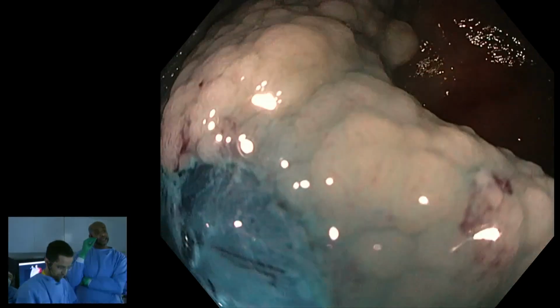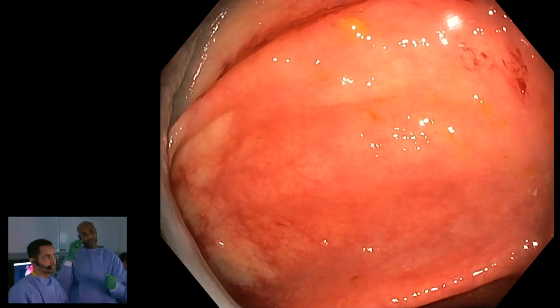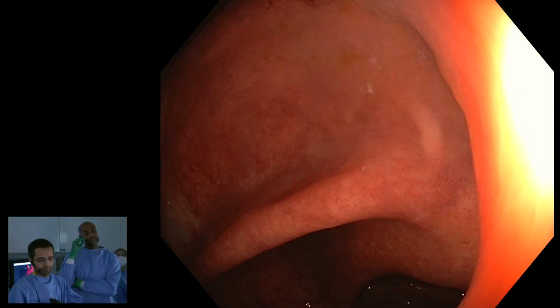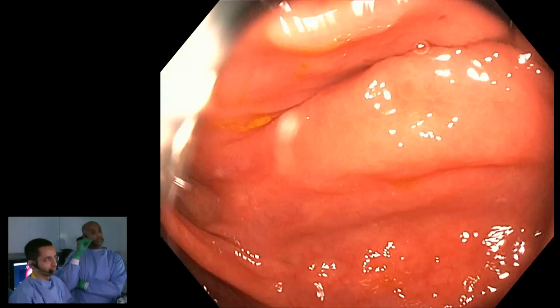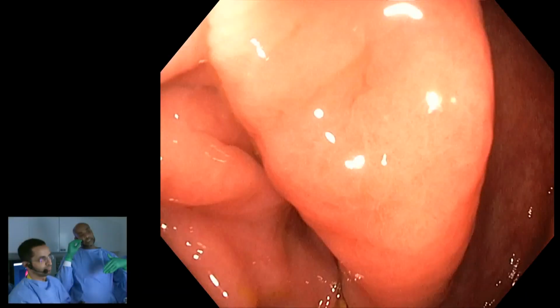Majid also did a great job by retroflexing in the right colon. Can you see if you can do it again? Sure. He actually retroflexed, and we spent a good amount of time assessing the lesion. So it has good access also with retroflexion. We will probably finish most of the rest of the lesion in retroflexion, where we have a much more stable scope and can visualize the lesion behind the folds. We will improve the access by utilizing dynamic submucosal injection, where we use the injection to improve the access.